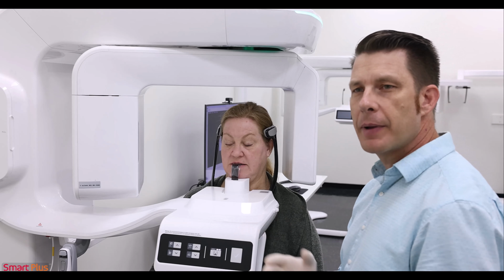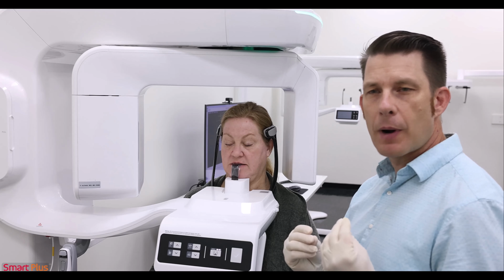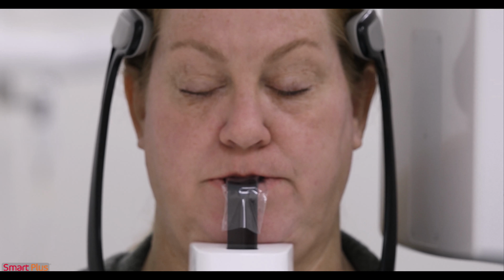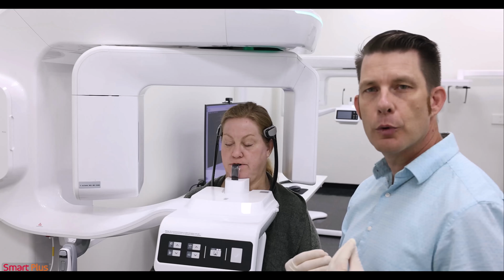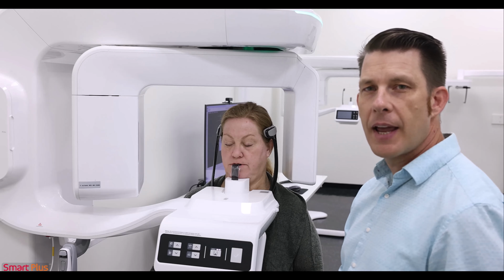The other thing with panoramic capture is I want to have the patient close their lips around the bite stick. Go ahead and swallow and keep the tongue flat to the roof of the mouth. Hold that position. We're going to go ahead and step out of the room and take our image.